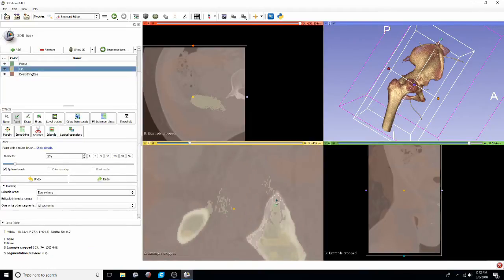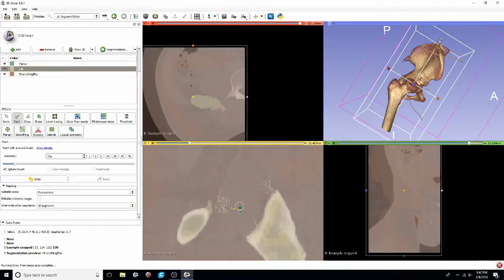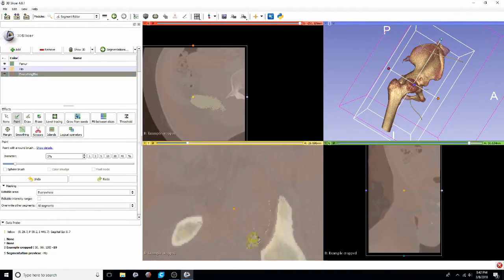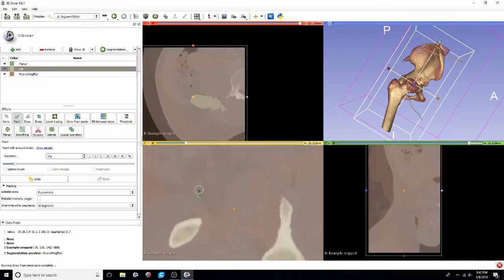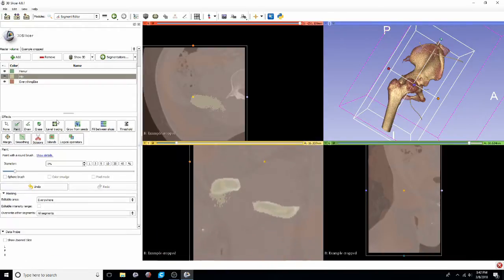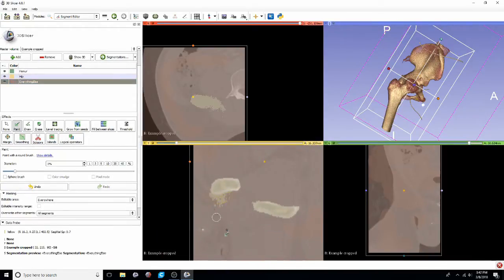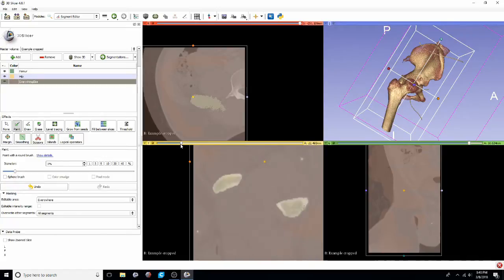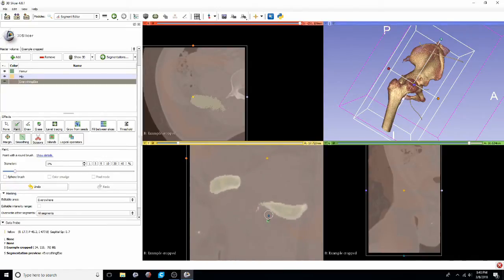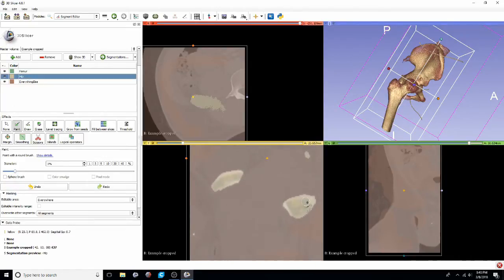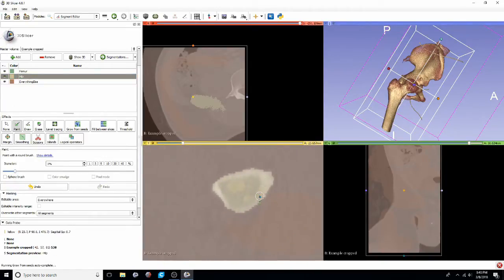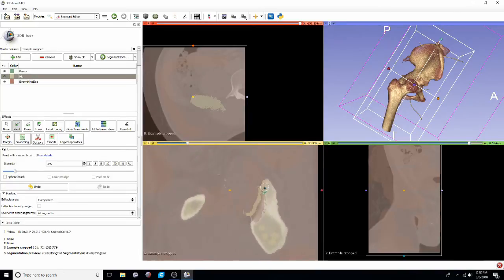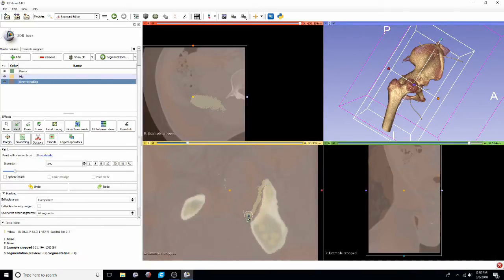If you kind of go over anatomy that shouldn't be included. I've sped up this cleaning up process a little bit and you'll see that if we have the auto update turned on, you can just go through and relabel structures as you see fit. And the computer will rerun that grow from seeds tool in that area that you're relabeling and showing it what should and shouldn't be labeled.